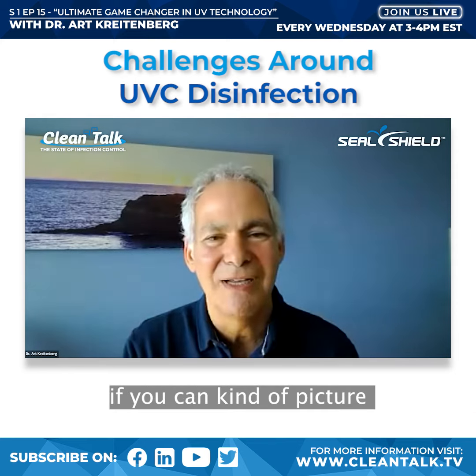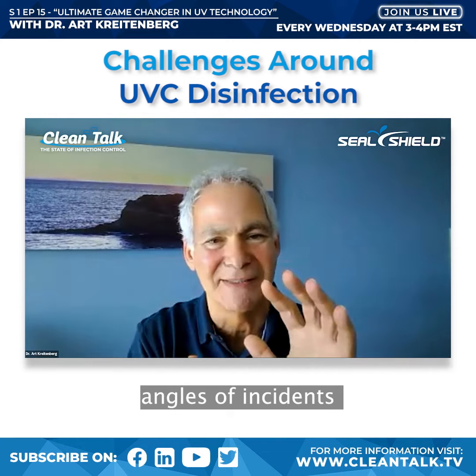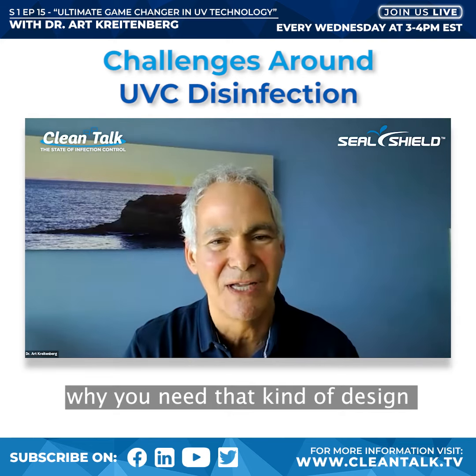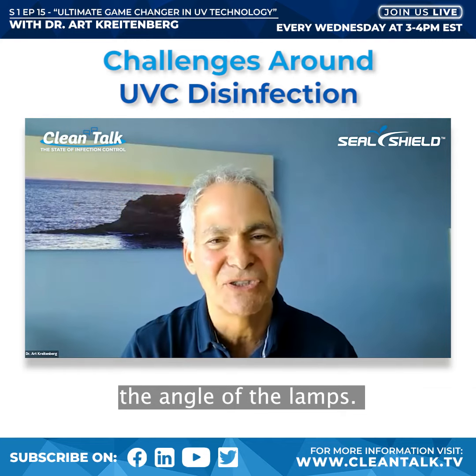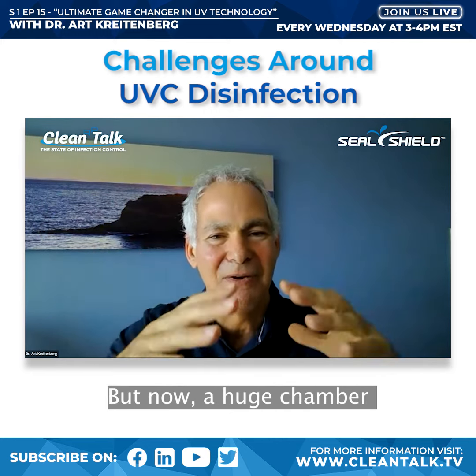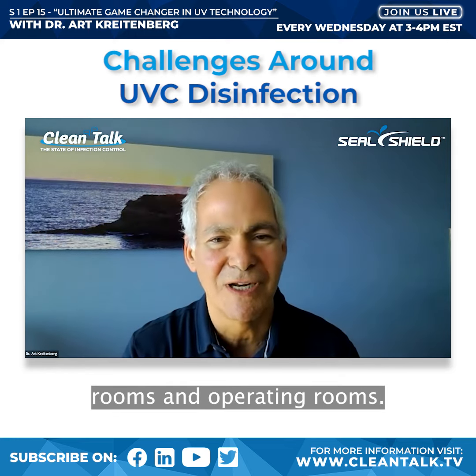However, if you can picture that chamber, and now you've got this device moving around the room and changing the angles of incidence so that you can reach all the surfaces of the room, now it starts to make sense why you need a design that's both mobile and can adjust the angle of the lamps. Because when you have a chamber with lamps on all sides, that's what you're doing. But for a huge chamber like an operating room, you have to come up with a more creative solution, which is what we've done for the hospital rooms and operating rooms.